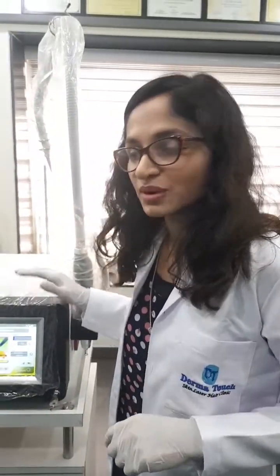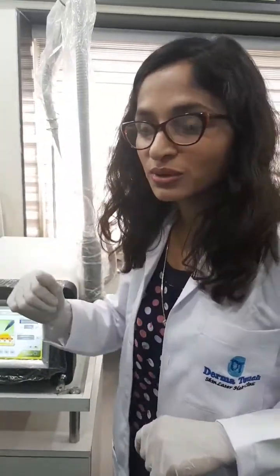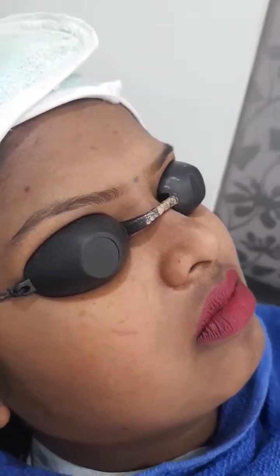There are many uses of this machine — maybe I have forgotten some, but we can use it for many many indications. Now let's focus on the treatment today. I am going to do a bindi tattoo removal. I have already applied an anesthesia cream to the patient — please clean the anesthesia cream. Okay, so this is the bindi tattoo we have, and we are going to treat it now.